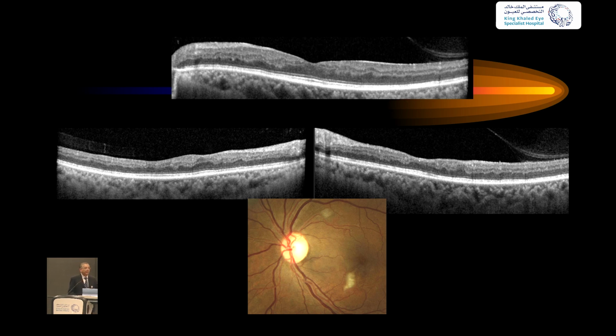Well, when I looked back at the last 100 patients, the patients who had this level of middle layer ischemia had already passed away, because it is actually a reflection of the entire body's small blood vessel disease. Many of them had passed away. So you can actually diagnose systemic conditions from looking at this.